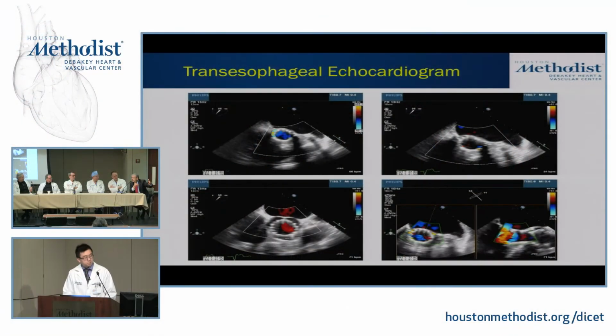For these prostheses, they're long. So when you start seeing a prosthesis in a cross-section, you're not at the level to detect the aortic regurgitation unless you are at the valve itself or even below it. So some of the images that you saw and you're displaying here don't show any regurgitation. It doesn't mean it's not there. It means that you're above the valve and still see the chicken wire of this prosthesis.